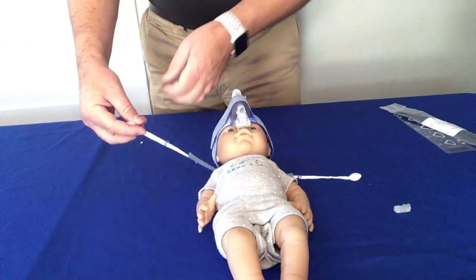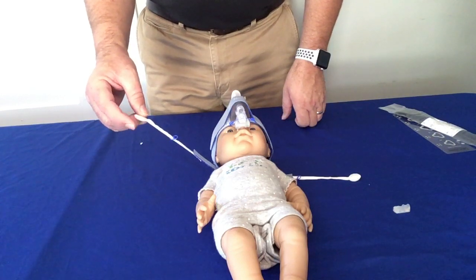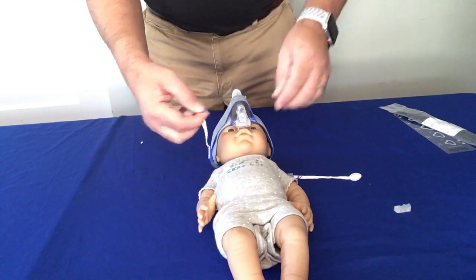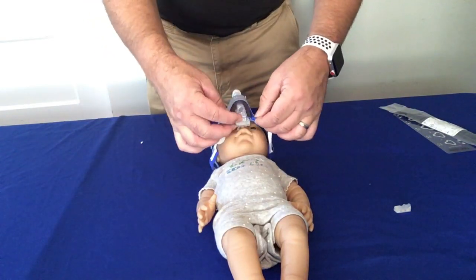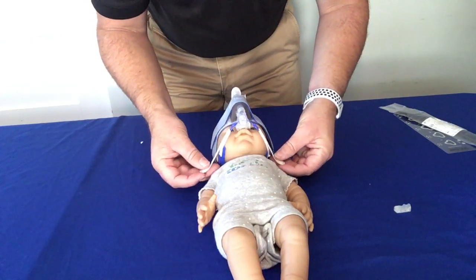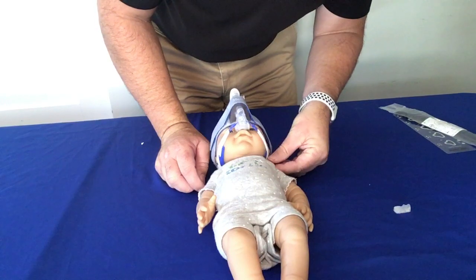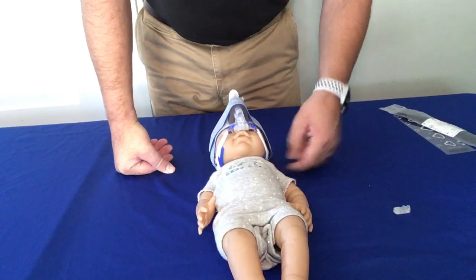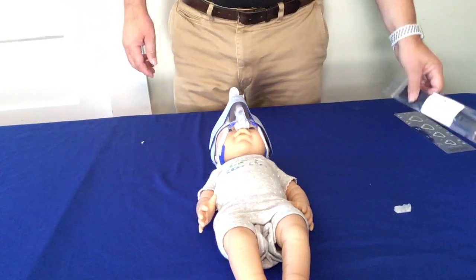Now, on these sizing straps, these discs here have very aggressive Velcro with sharp edges. So you do have to be mindful that these portions are not touching the shoulder of the baby. So again, it also has a back-to-back D-ring, much like the bonnet does. And you click one on one side and one on the other. And like you would with a bonnet, make sure the straps go down to the jawline. But now at this moment, when you click it in, be sure to be on the upper side of the blue strap so that it is not running into the shoulders of the baby, because these do have sharp edges and you want to make sure that it is off of the shoulders of your baby.